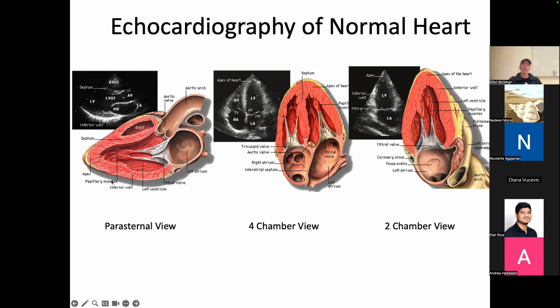And so this is the view of the human heart. You've got the aorta here, right? The aortic valve here. The left atrium is here, right? And I'm going to put this laser back on here.